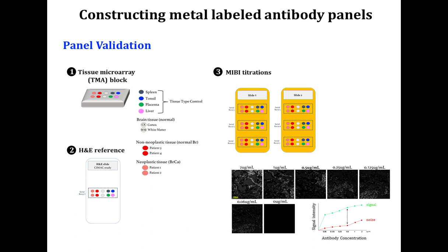The expected staining pattern should be noted for reaction comprising of neoplastic and non-neoplastic tissue control. When a negative tissue control is unavailable, appropriate ROIs, or regions of interest, with both positive and negative areas will be evaluated.